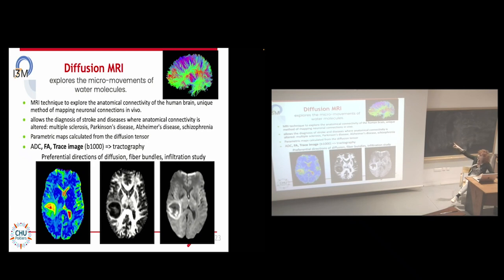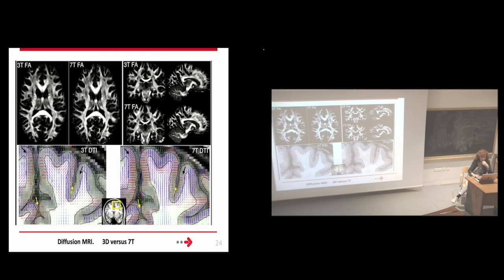But you can see tractography, which is very nice imaging with fibers with different colors, and that is very helpful, for example, when a surgeon has to extract a tumor, to analyze where is the tumor regarding the different fibers of the brain, to avoid destroying some important part of these fibers. One more time, the difference between 3 Tesla and 7 Tesla for diffusion imaging. And you have, of course, more information, as you can see with this imaging. You have more information regarding the diffusion, regarding the fibers between the different parts of the brain.